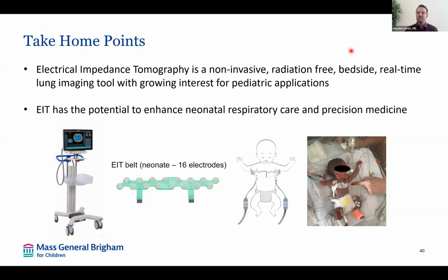Yeah, thank you for whoever submitted that question. Again, this is an area of my own research, trying to compare EIT PEEP titrations with other lung mechanics and see if they're comparable or in which patients they may differ, such as PEEP for best compliance or improved oxygenation. And I think if there are others doing the same work, it's really important, because not every patient is going to have EIT, and not every patient is going to tolerate true PEEP titration. So how can we look at other parameters?